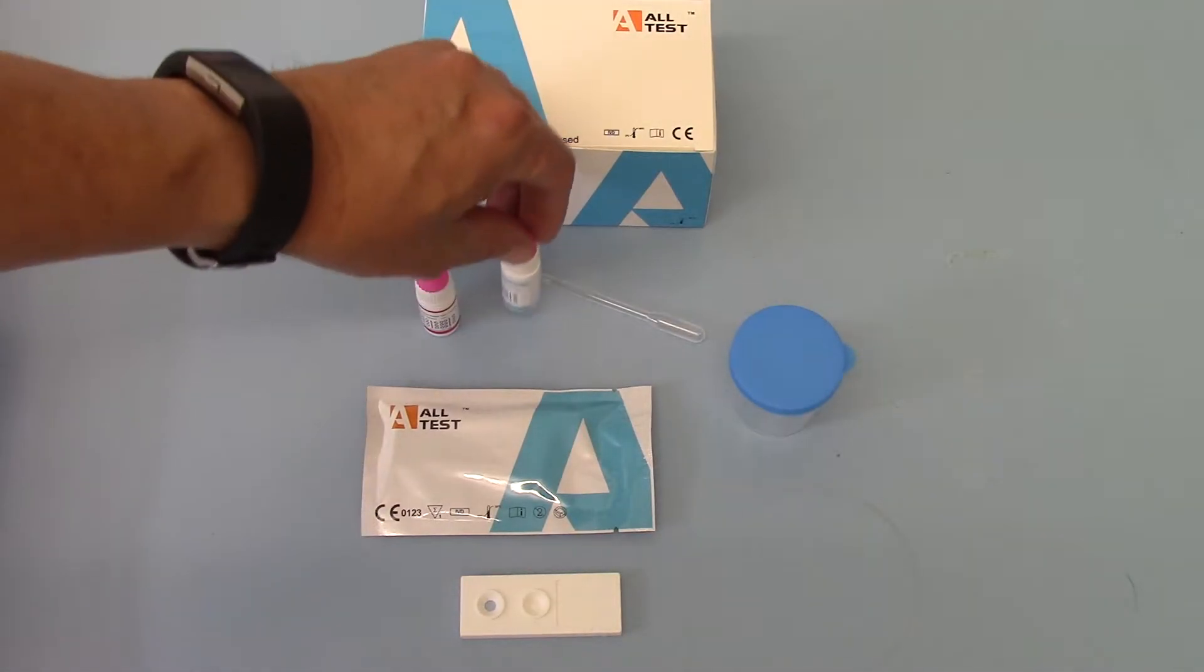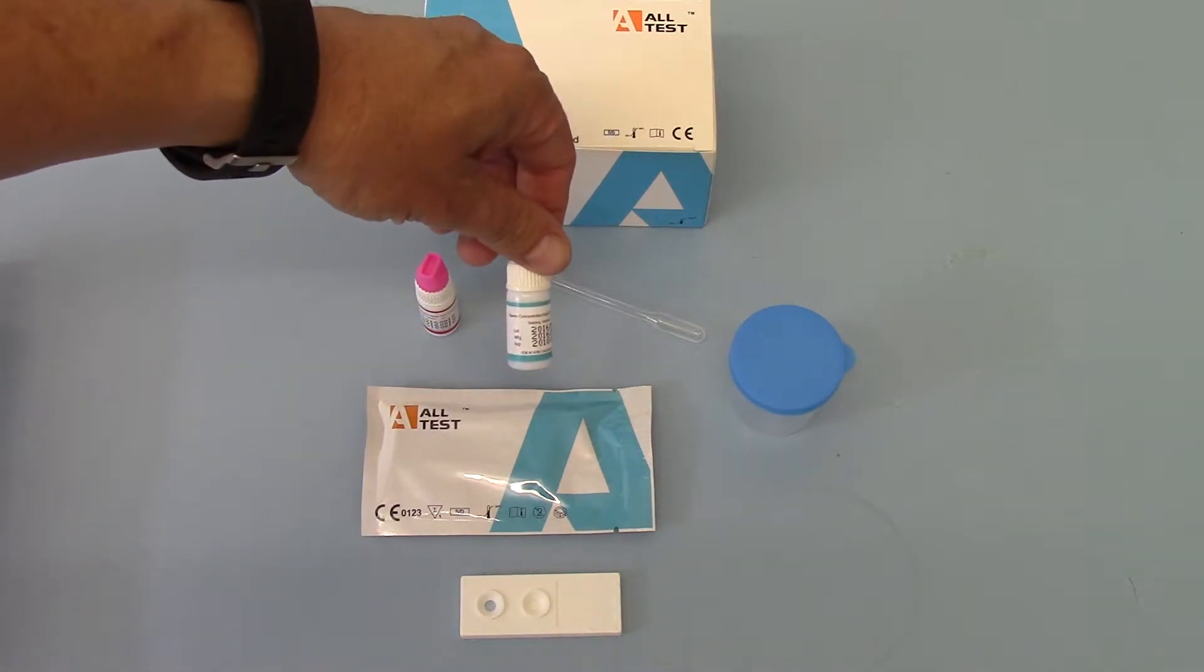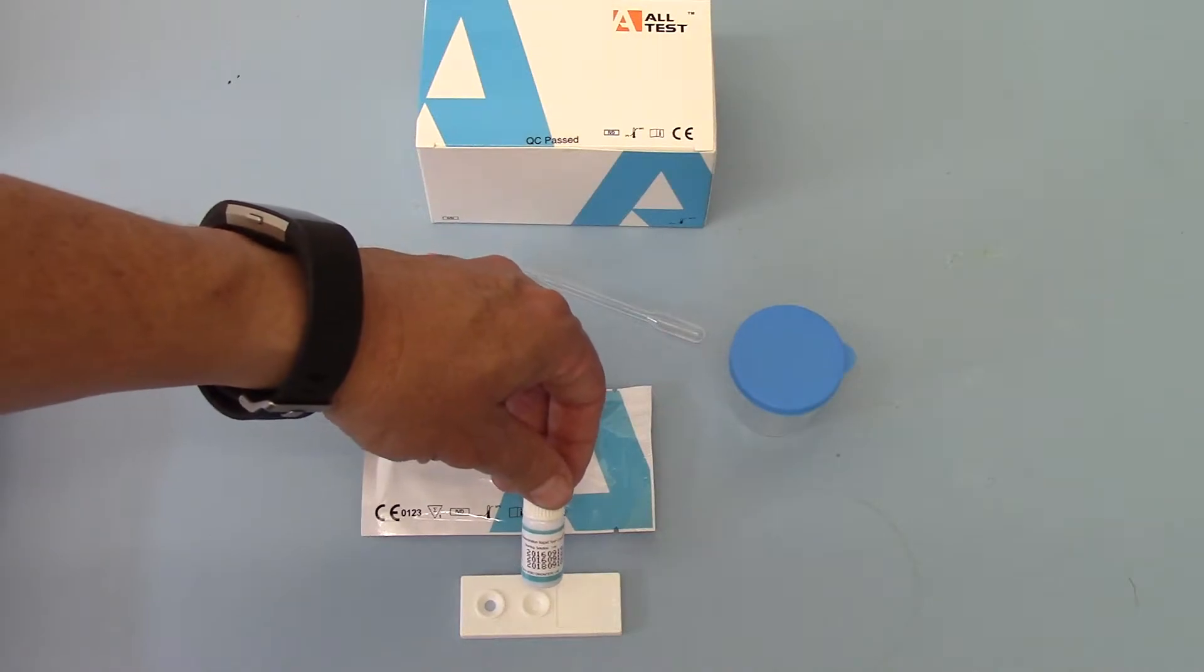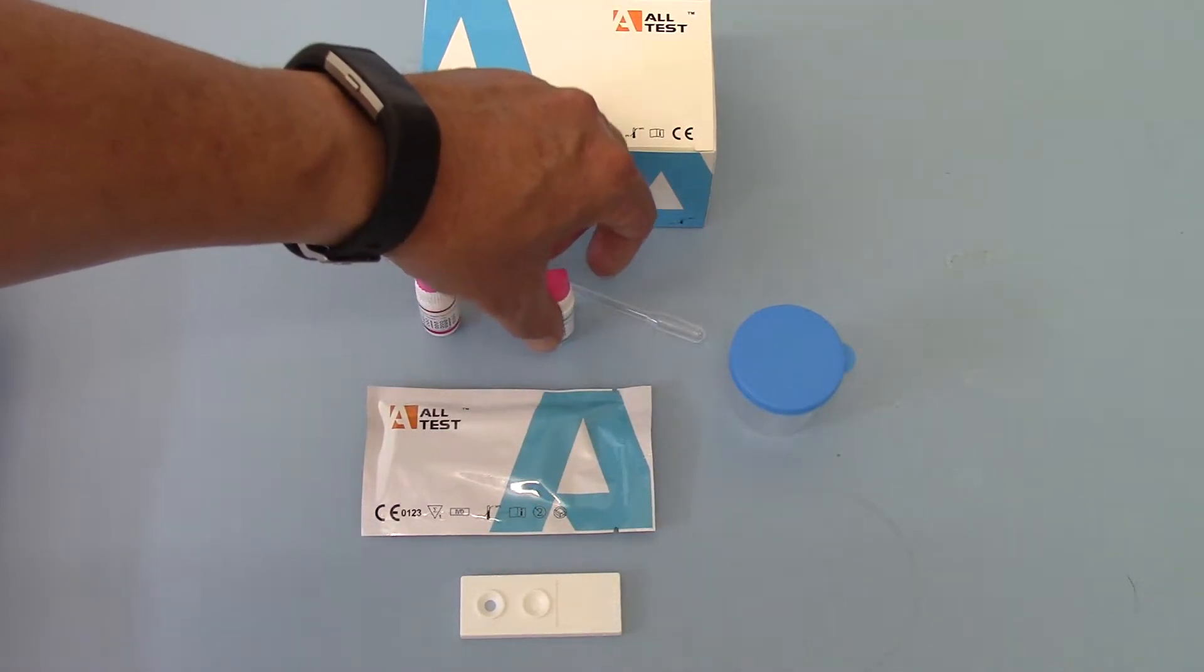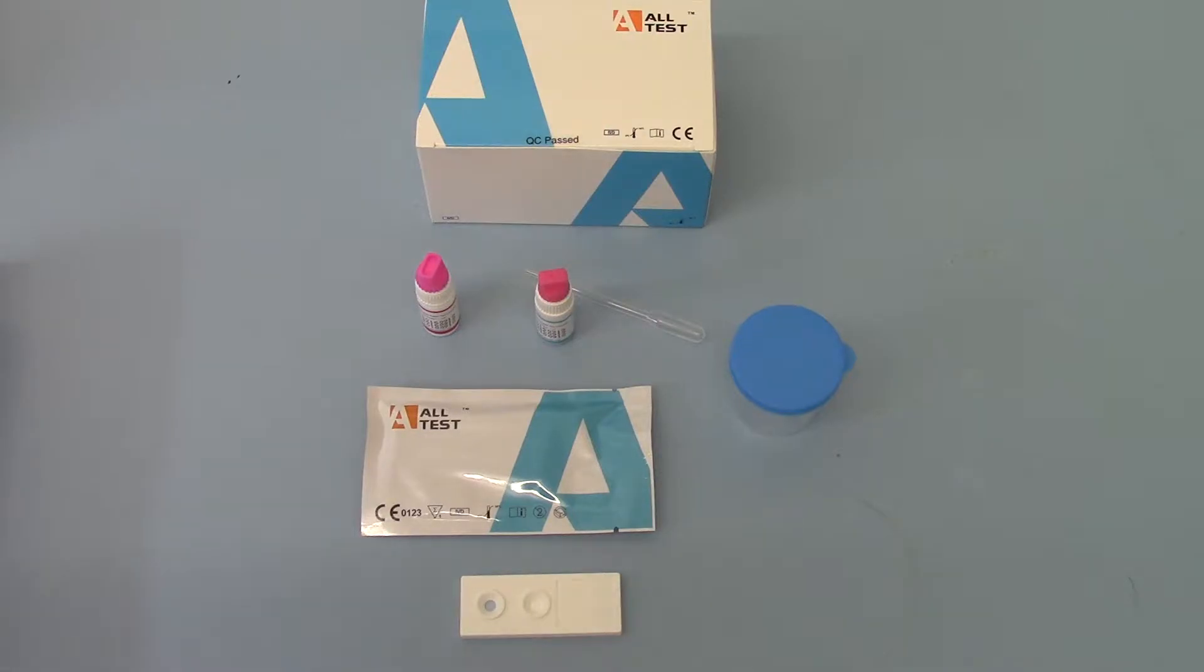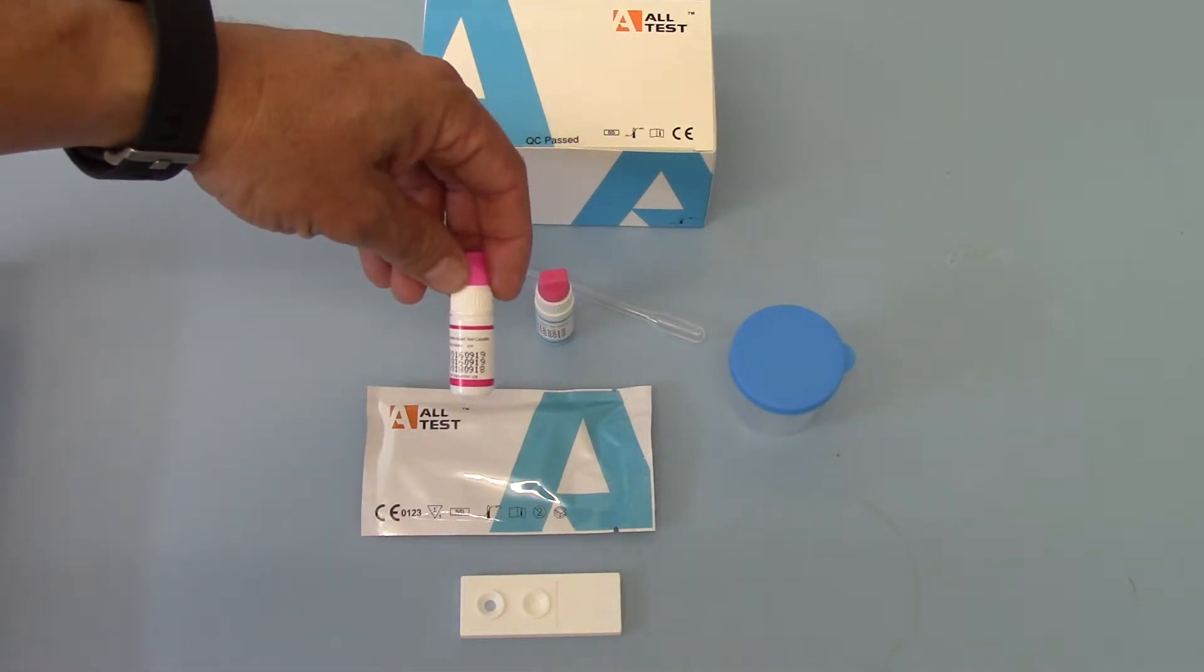After one to two minutes you take your blue staining solution and add three drops to sample well A. You leave that to soak in for one to two minutes.